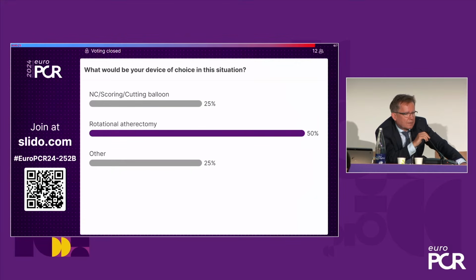devices with a different approach. And I think in my lab, I totally agree with Hanet. I'm going with a laser. In this situation, with a laser, probably the 0.9 millimeter, it's with a very good profile.